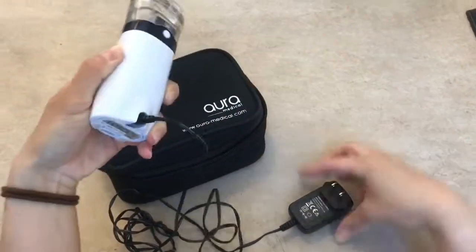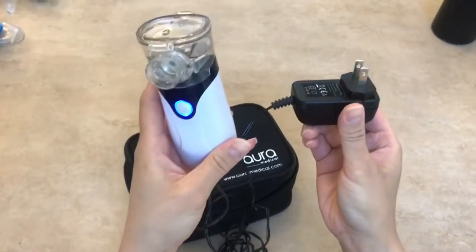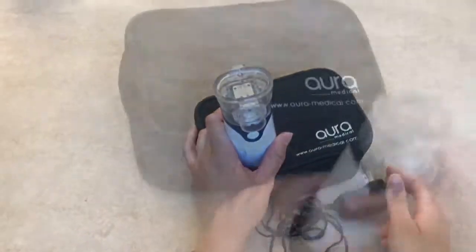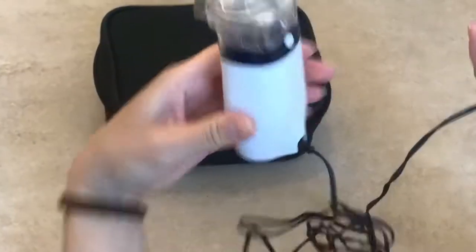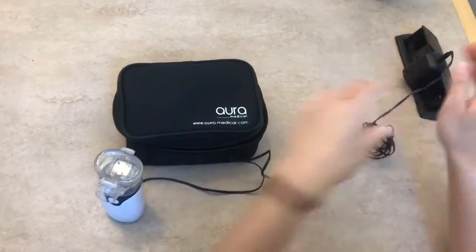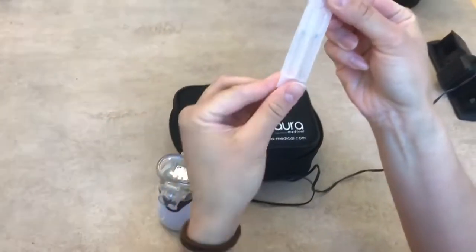If you want a stronger power, you can plug it in — I usually like to plug it in. You see a little blue light right there and that tells you it's ready to go. So this is the setup; I'm going to go ahead and plug this portion in, open it up, and pop in a nebulizer treatment.